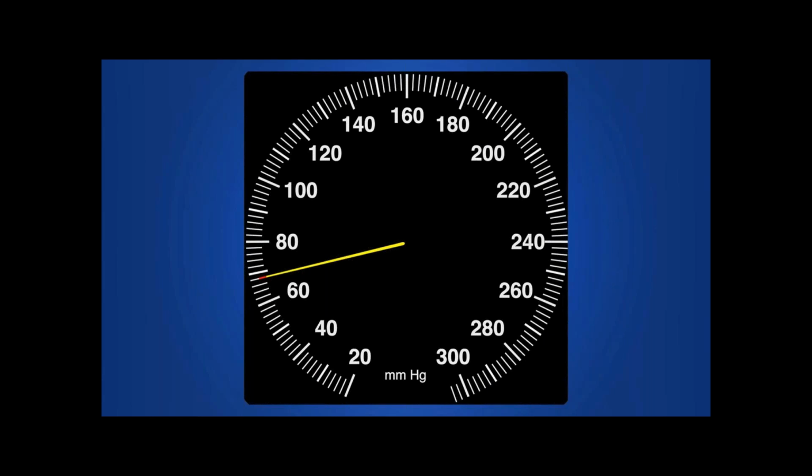Concentrate on the tip of the needle and the line that it's pointing to. How much does this line represent? If you stated 68, you are correct. So how much does this line represent? If you stated 112, you are correct. And how much does this line represent? If you stated 294, you are absolutely correct.